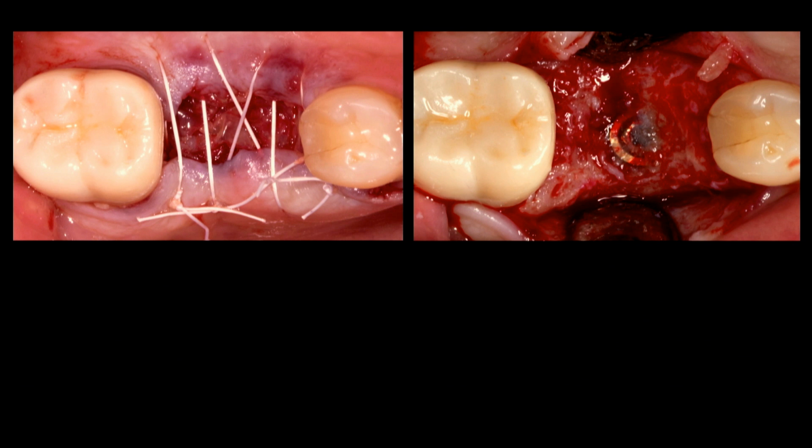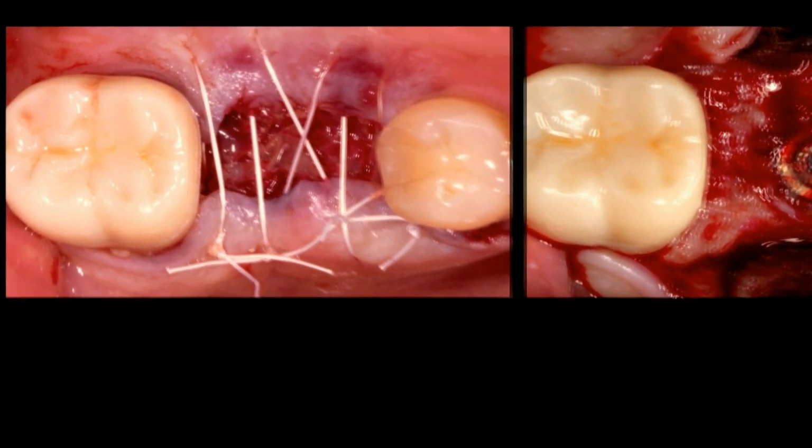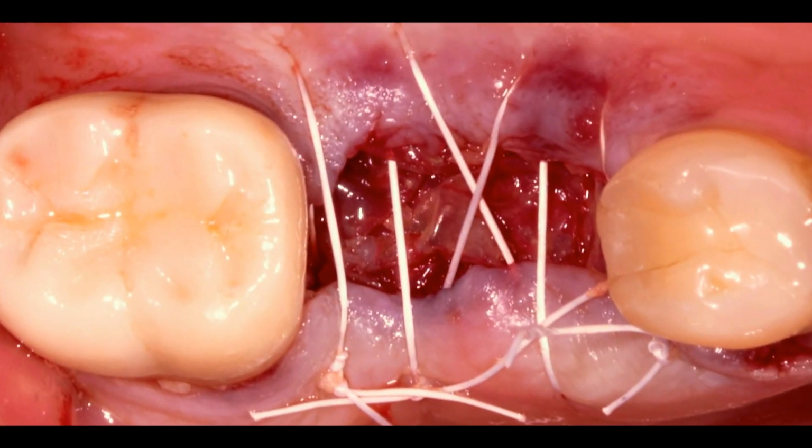get our teeth out atraumatically. Well, in this case, I placed an immediate implant. And then I just tuck the BioXclude right over the occlusal. Do I need a membrane there, a barrier function? Not necessarily. And if it's a small socket, I really don't worry that the bone graft's going to come out. But in real life, I want to treat my patients the way I'd want to be treated. I want to have the best chance of having a good outcome. And so I will often do this if I'm not able to immediately load the implant.